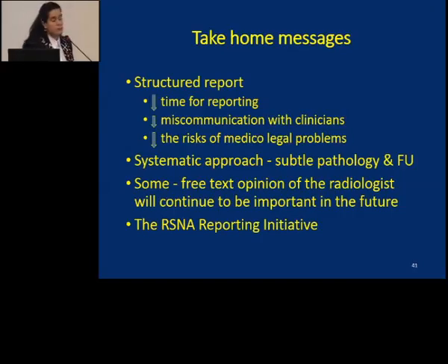So, for conclusion, it could be helpful for you if you use this structured report, because you can reduce your errors, you can reduce your time for reporting, and hopefully reduce the risk of medico-legal problems. It will be helpful for you because a systematic approach can lead to detection of subtle pathologies, and you can follow up the patients. But some of the radiologists believe that structured reporting is not as good as the free text opinion, and that free text will be the best option.